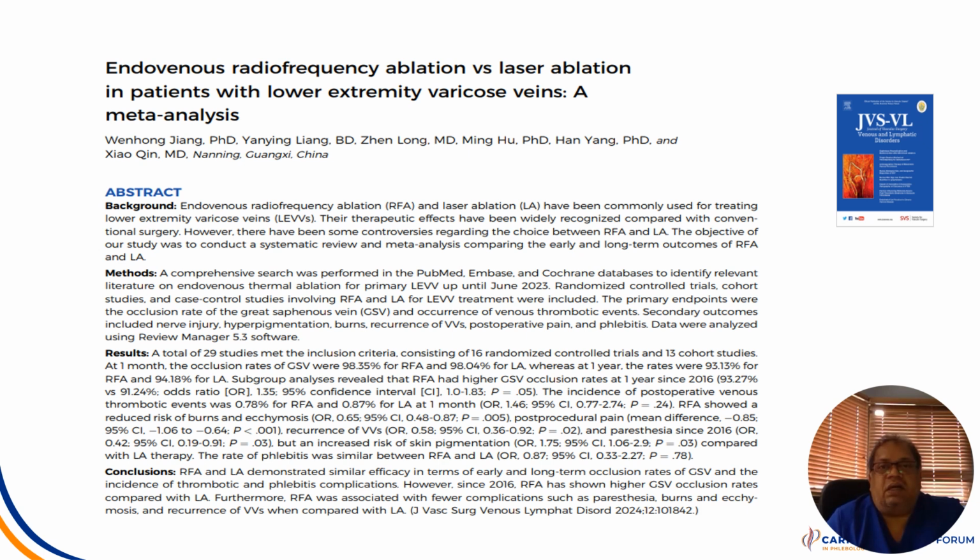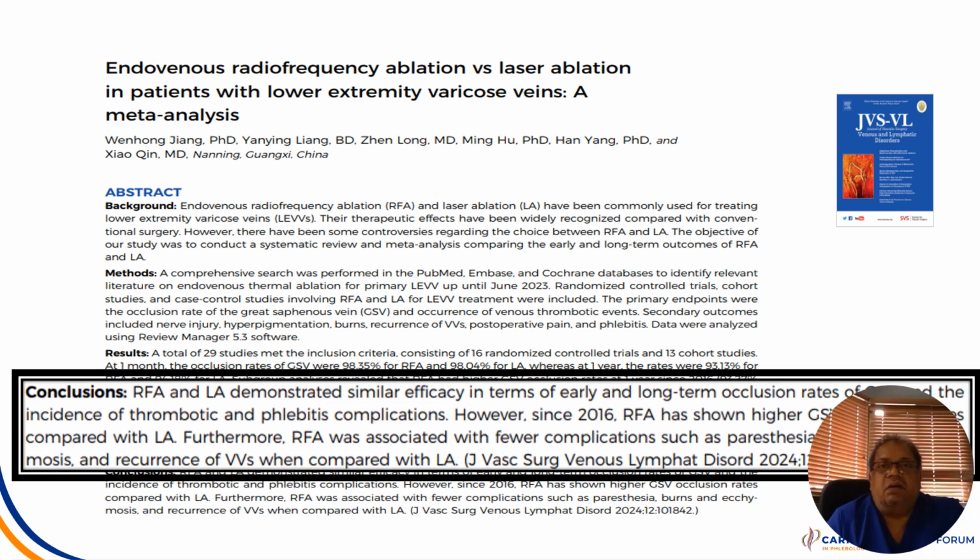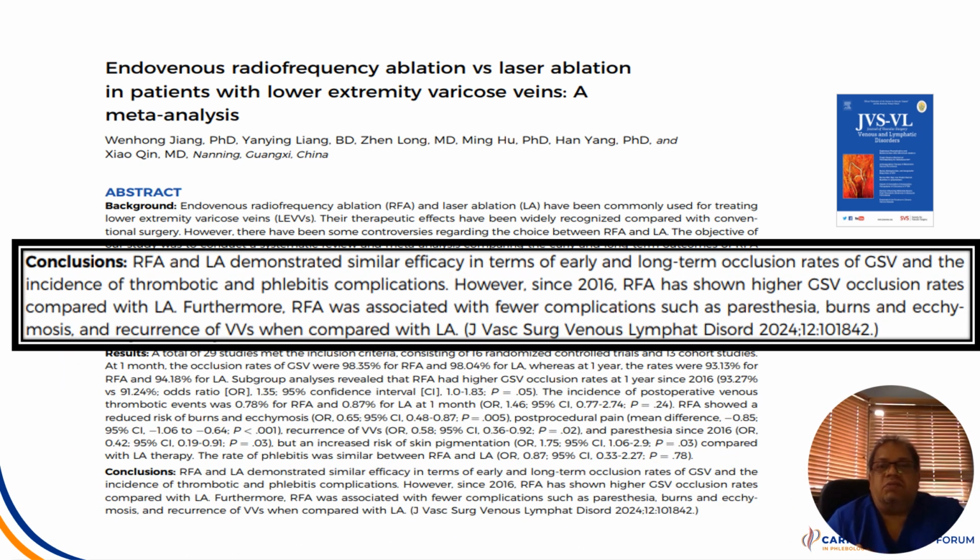Another large meta-analysis demonstrated the efficacy in terms of long-term occlusion rates of the GSV when looking at both radiofrequency ablation and laser ablation.